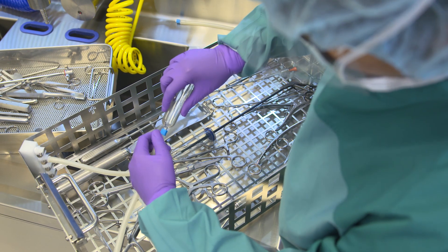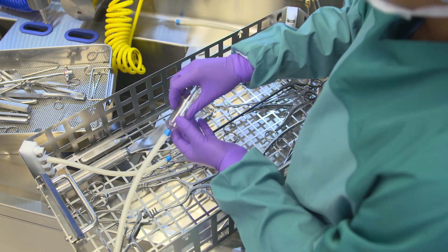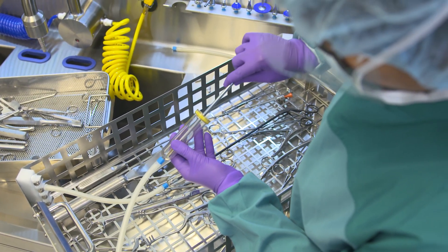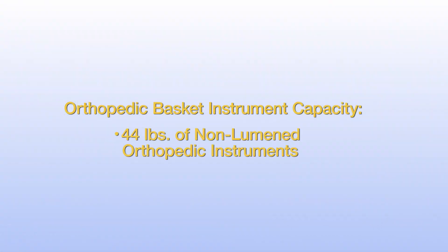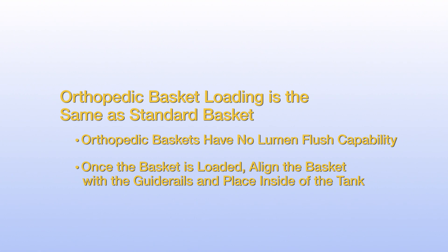For non-ported lumened instruments, use one of the four distal connectors to flush lumens. Choose the correct distal connector based on the instrument size, connect to the instrument, and place in the basket. The orthopedic basket for the InnaWave PCF can hold up to 44 pounds of non-lumened orthopedic instruments. This additional basket is loaded the same way as the standard basket, only with no lumen flushing capabilities. Once the basket is properly loaded, gently place it inside the tank, aligning it with the guide rails.